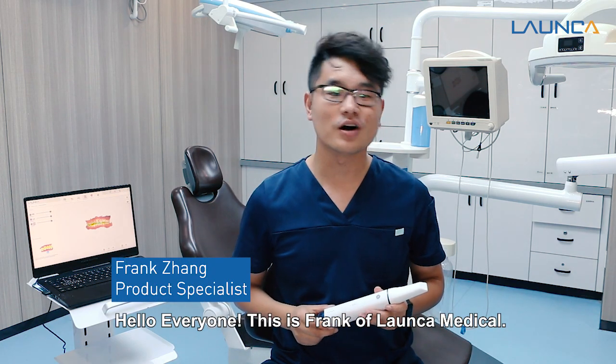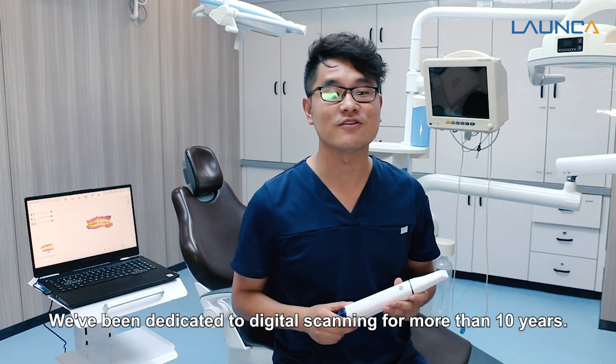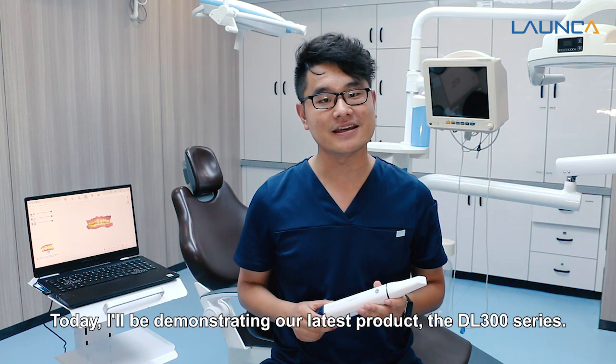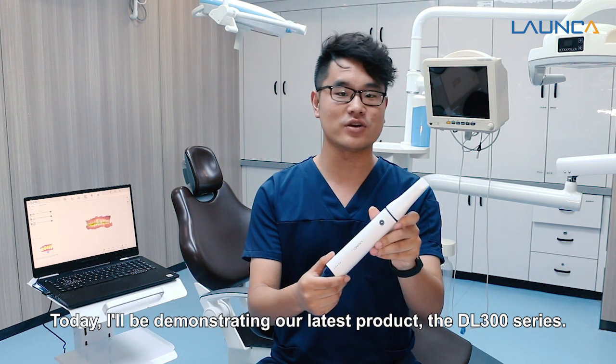Hello everyone, this is Frank of Launca Medical. We have been dedicated to digital scanning for more than 10 years. Today I will be demonstrating our latest product, the DL300 series.